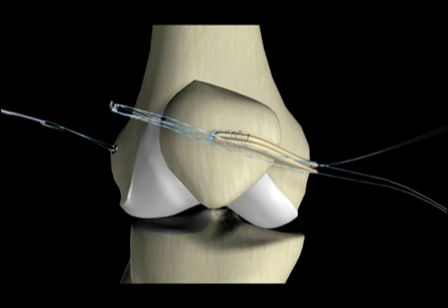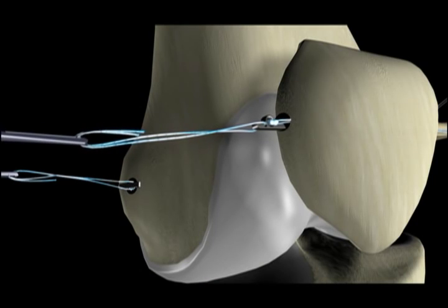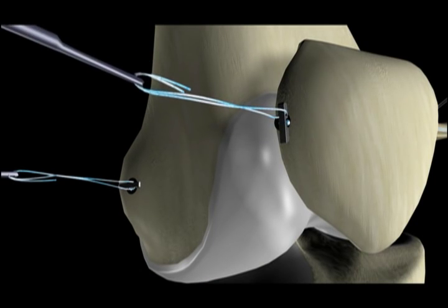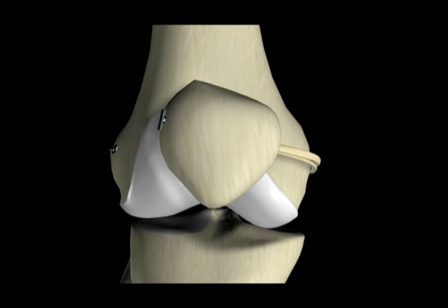The two stitches from the free limbs are tied to a second toggle lock device via the zip-loop suture looped ends. The toggle lock device is passed and then flipped on the lateral patellar cortex. The zip strands of the toggle lock device are then pulled upon to introduce the free limbs of graft into the tunnel.